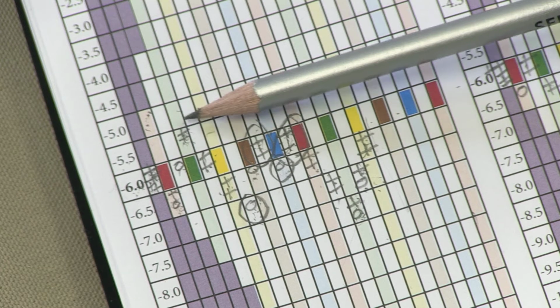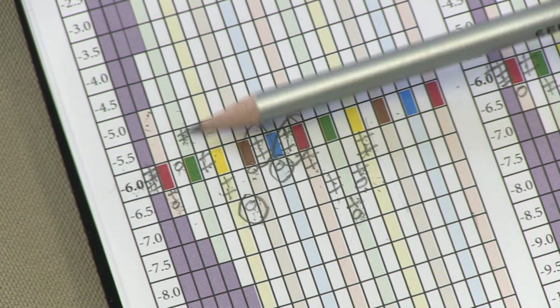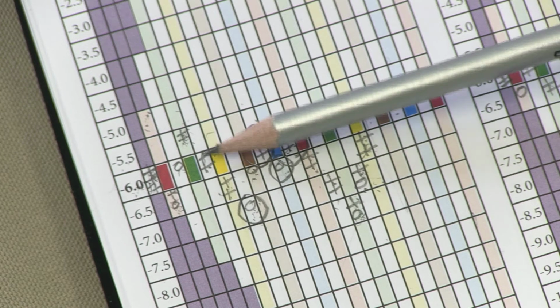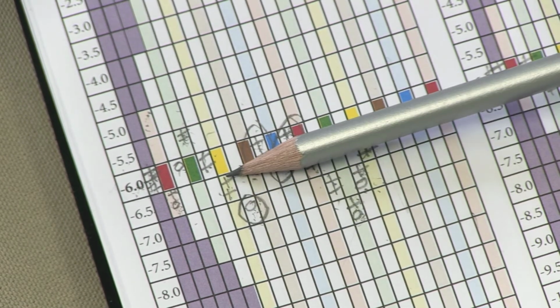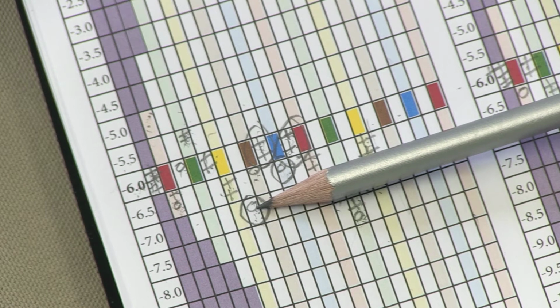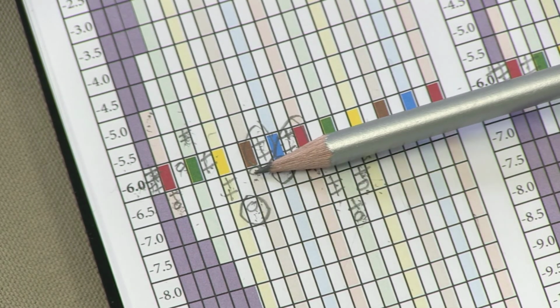We moved on up to the next highest concentration, and then we got both sets of pairs correct there, so then we moved down a single step, and then at that level we had 2 sets of pairs correct again, so we moved down. Again, we had 2 sets of pairs correct at the next lower level, so we moved down, but we missed the first set of pairs, so we didn't present the second at that level, at 10 to the minus 7, so we moved back up.